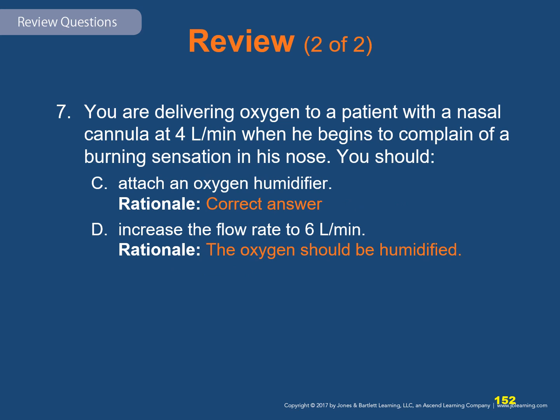C, attach an oxygen humidifier. That's the correct answer. D, increase the flow rate to 6 liters per minute. That's not going to do anything except dry his nose out faster. So humidity is your answer here.